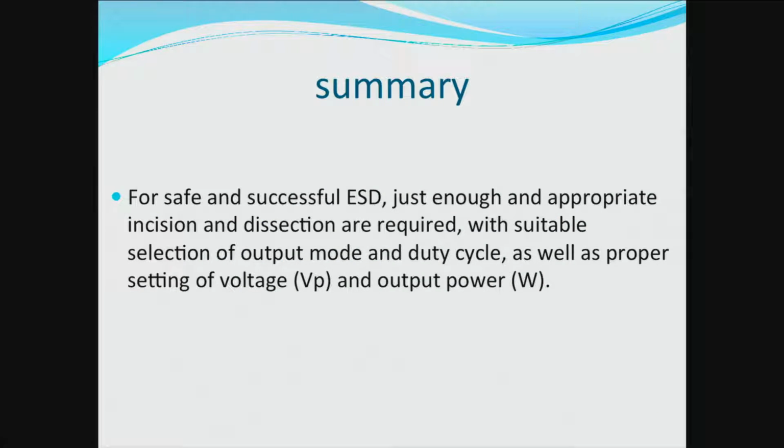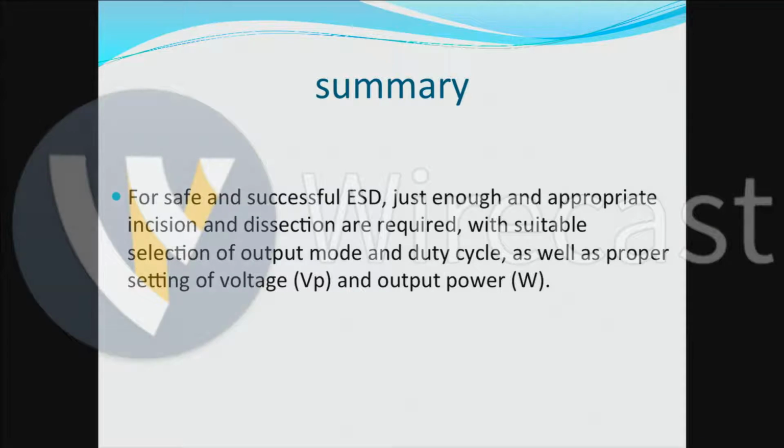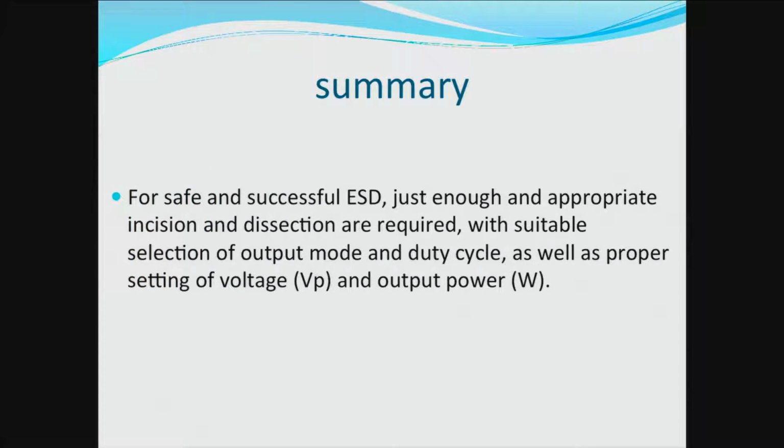And for conclusion, for the safe and successful ESD, just and enough appropriate incision or dissection are required, with suitable selection of output mode and the duty cycle, as well as proper setting of voltage and output power. Thank you for your attention.